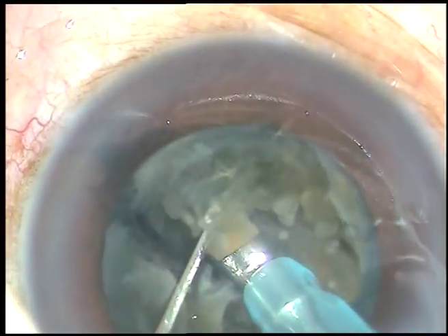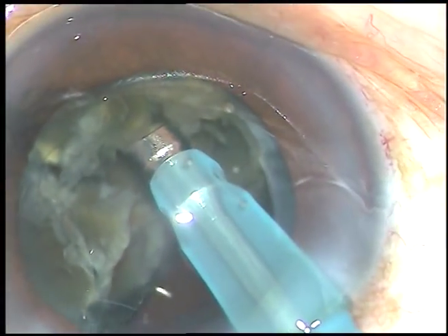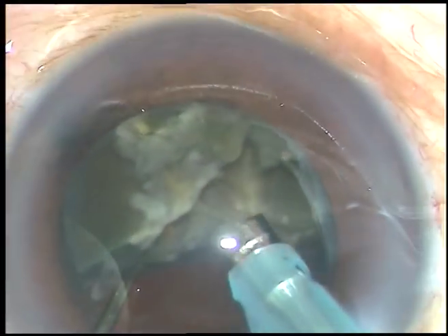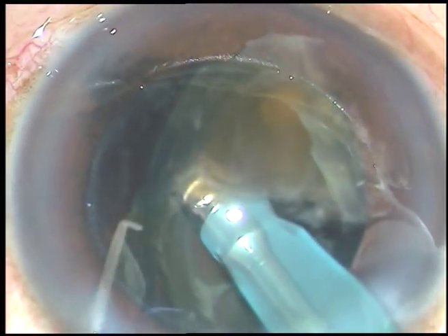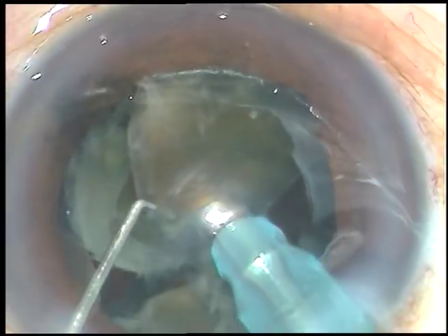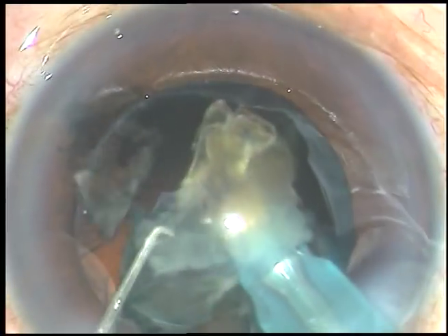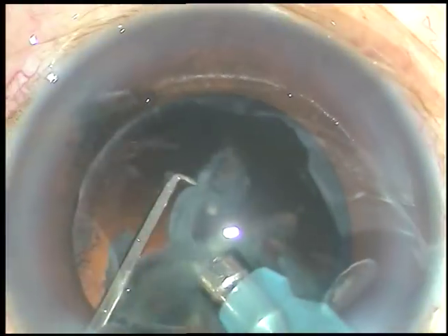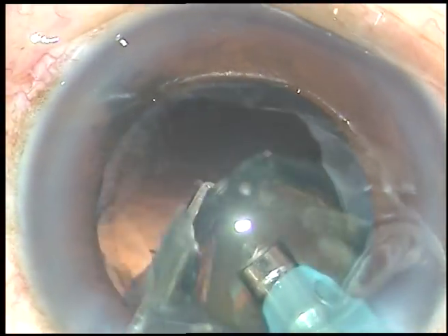These three fragments are still attached at the apex, at the inner ridge. I am trying to lift it up, and what has happened is one fragment has popped out. But don't chase the nucleus. Remain at the iris plane. Apply vacuum. Let the piece come down. Don't chase the fragment that has popped out. Remain at the iris plane or in the bag. Apply vacuum. Let the piece come down and then emulsify.